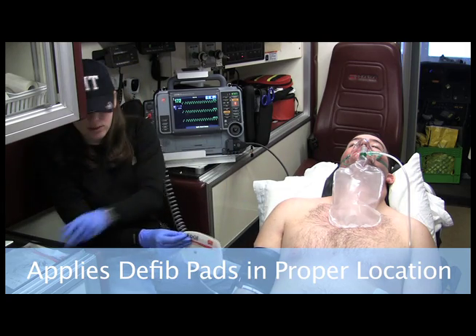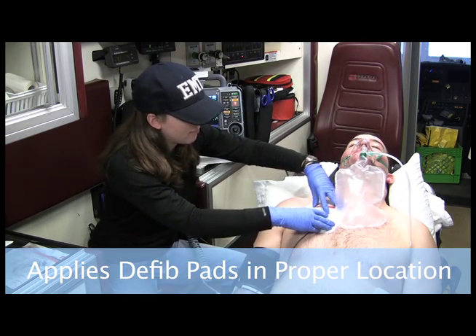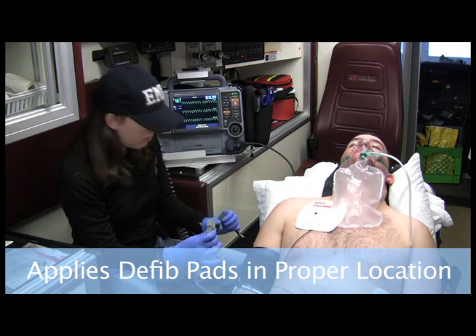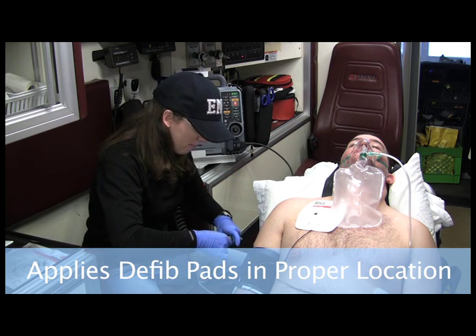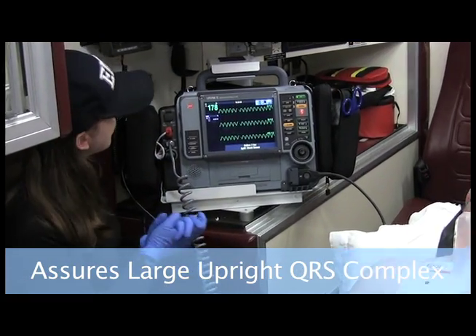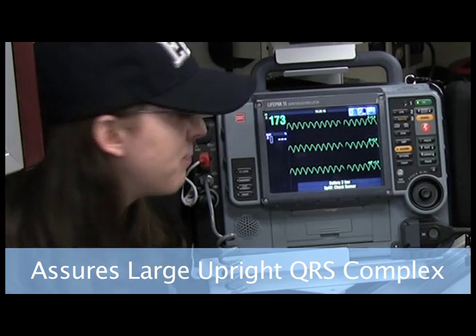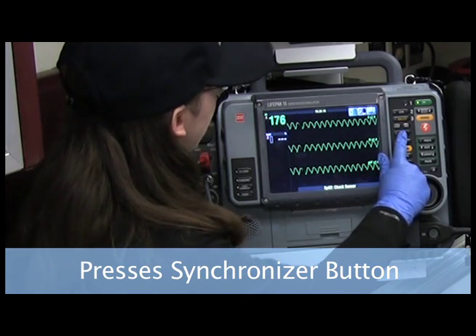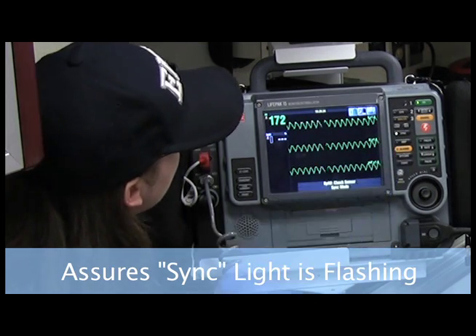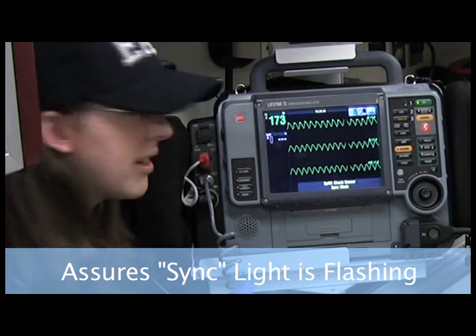I want to make sure my sites are dry, that there's not a lot of hair, before placing the pads. Make sure I'm hooking them up correctly. So I'm rechecking the monitor — I am still indeed seeing a wide complex tachycardia. So I want to go ahead with synchronized cardioversion. I want to hit the sync button. I am noticing that it's syncing — the little light is flashing and I am seeing the triangles, so it is syncing correctly.